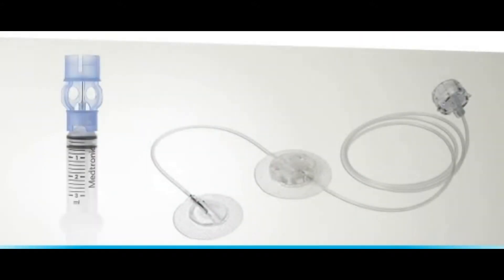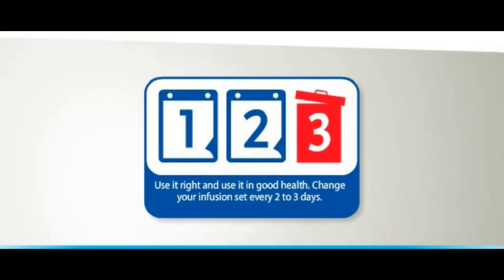Medtronic has developed a full range of infusion sets and reservoirs especially for your Paradigm Veo. Whichever one you choose, it's important to change it every two to three days to optimise the effectiveness of your therapy and reduce the risk of infection.